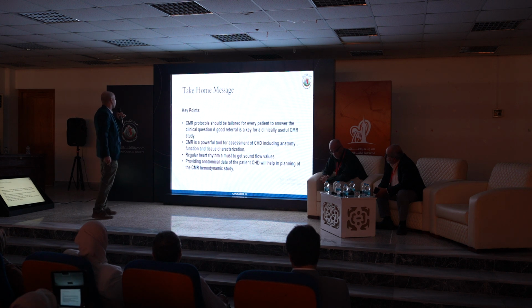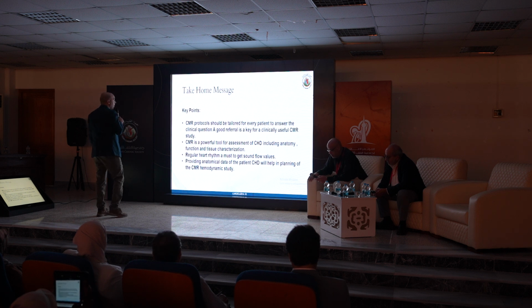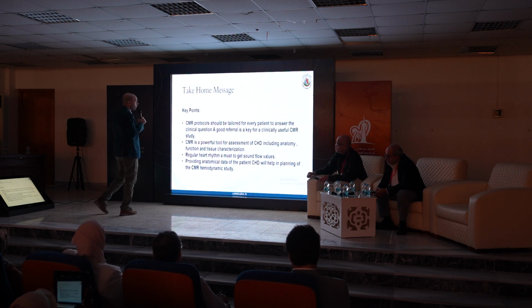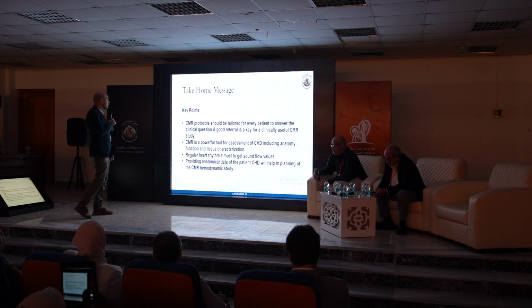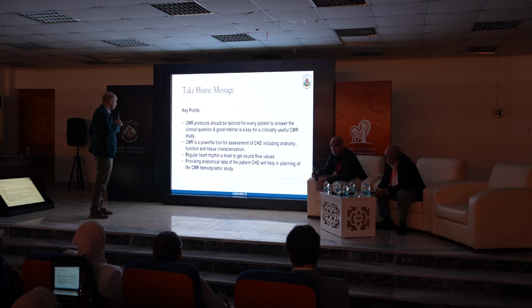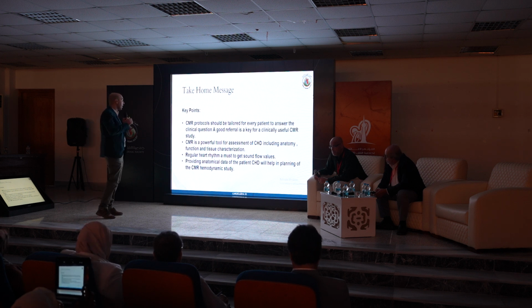Take-home message. CMR protocol should be tailored for every patient to answer the clinical question. A good referral is a key for clinically useful CMR study. CMR is a powerful tool for assessment of congenital heart defects, including anatomy, function, and tissue characterization. Regular heart rate is a must to get sound flow volumes. Providing anatomical data of the patient's congenital heart defect will help in planning of the CMR hemodynamic study.